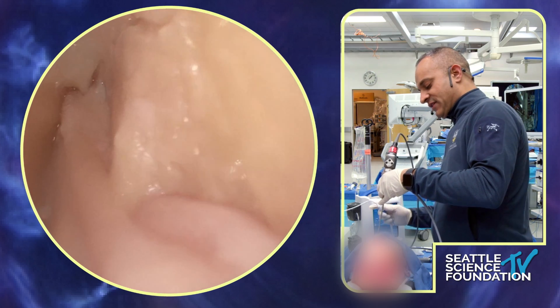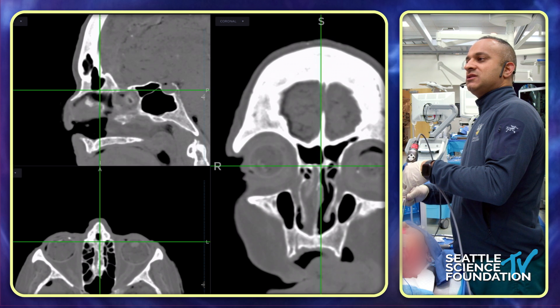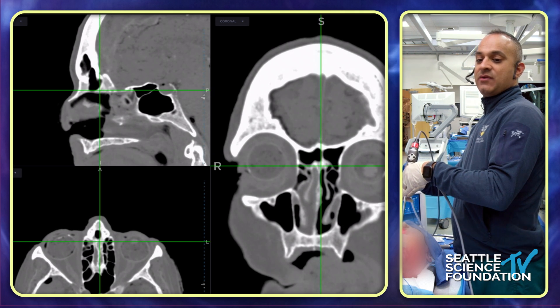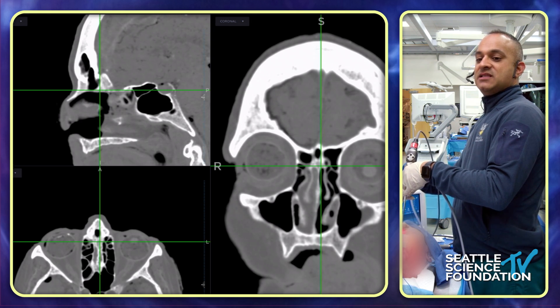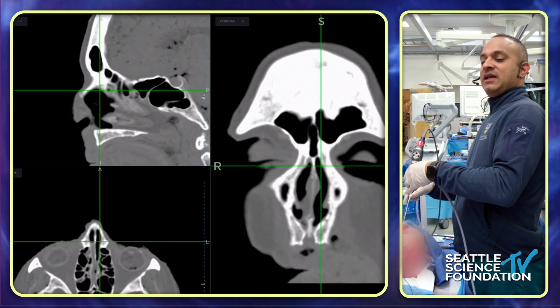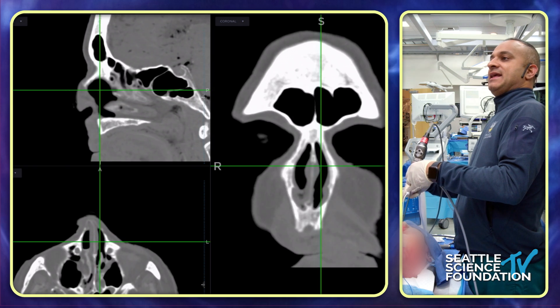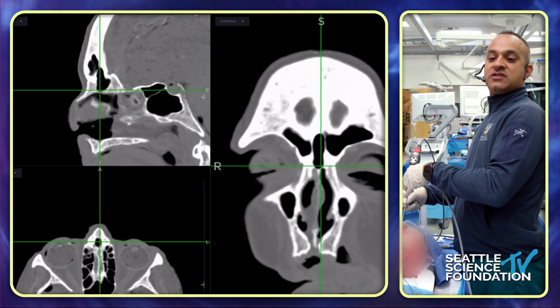I might try to go to the navigation view to show us that — that is the first olfactory neuron. You can see on axial that we're right at the serpent's tongue where you see it projecting anteriorly, because medially it is brain. Laterally there is still airspace that heads posteriorly.